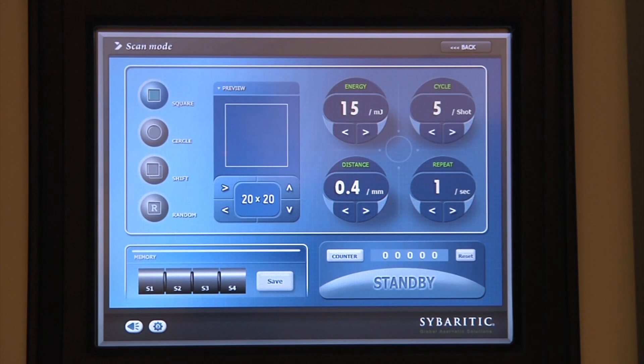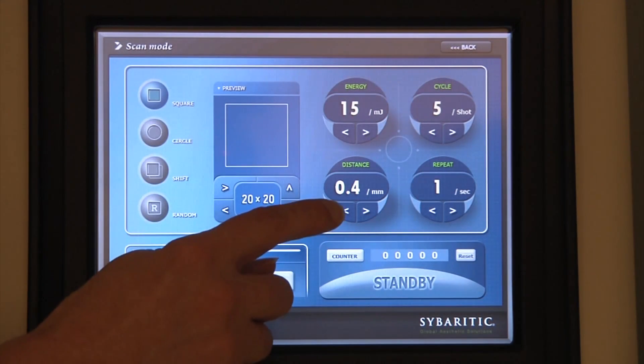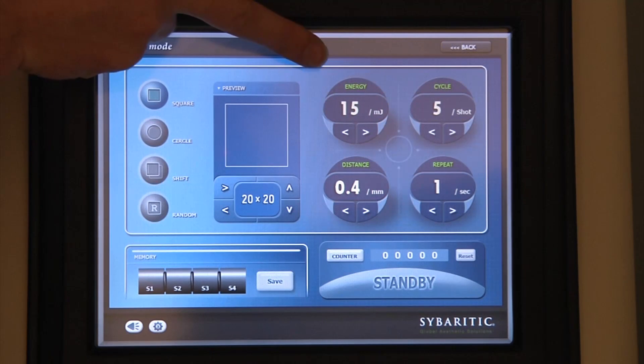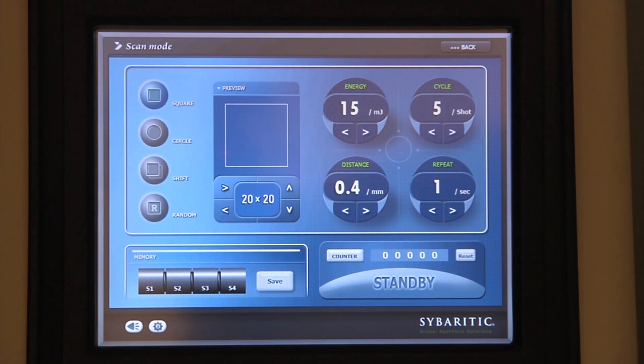And actually we want to provide more coverage to the skin. The way I would set this is to have a very small distance between our microthermal zones so that we can affect a maximum coverage. However, I would decrease the energy settings to 15 millijoules in order to affect a more superficial treatment.